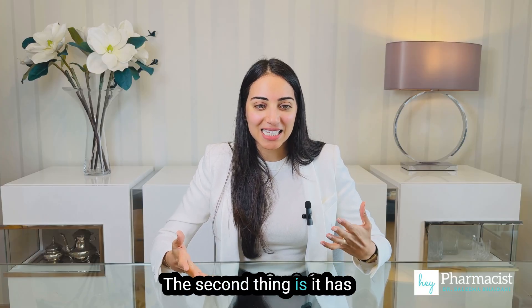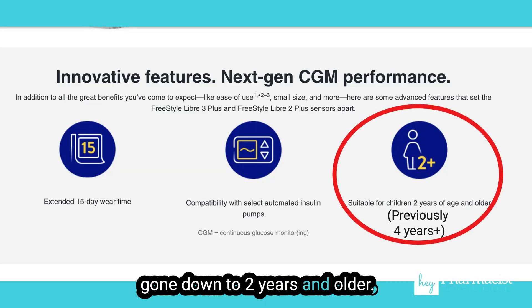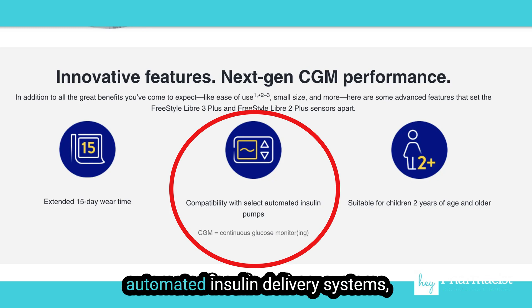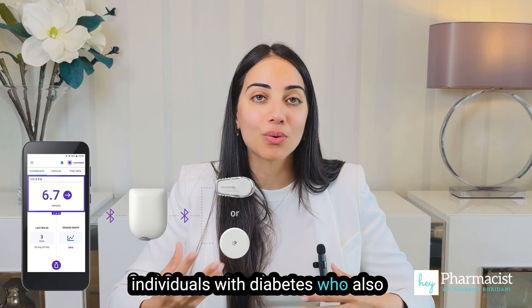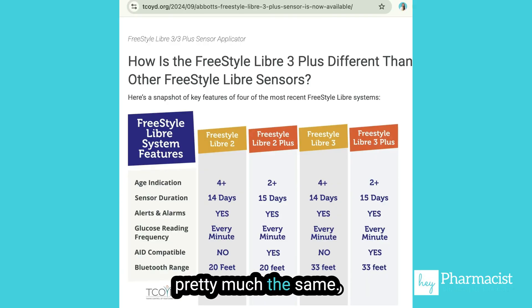The second thing is it has expanded coverage — it's gone down to two years and older. Lastly, it's built to be able to connect with some of our more automated insulin delivery systems, which can be super useful for many individuals with diabetes who also use these other types of devices. Everything else is pretty much the same.